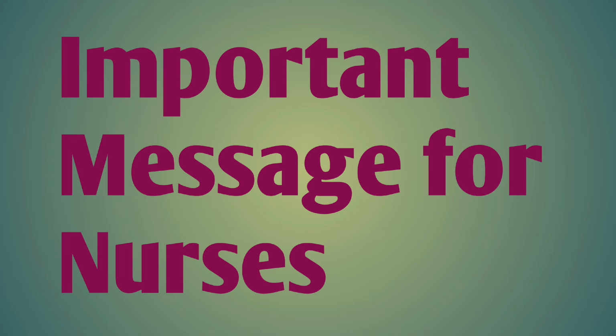Important message for nurses. There is one very important point I want every nurse to remember. Never interpret an ECG separately from the patient. Always consider the patient's symptoms, vital signs, clinical condition, previous ECGs when available, and any new changes compared with the patient's baseline. If you see a new or concerning ECG change, especially in a patient who is symptomatic or unstable, do not ignore it. Assess the patient promptly and escalate according to your hospital policy and clinical protocol.